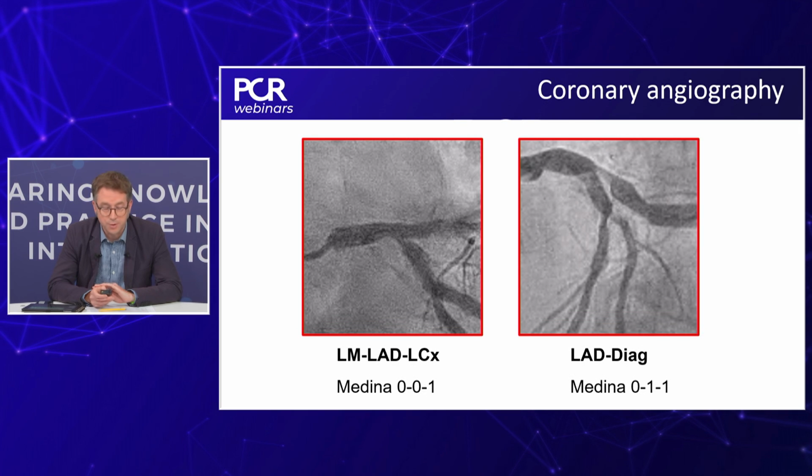So you have to make that decision before. But if needed, you can do it after stenting, but you have to open the struts before putting DCB to the side vessel. So that's an important point. If we could just have the slides back, we'll just expand on that maybe while we get Gabor's opinion too.